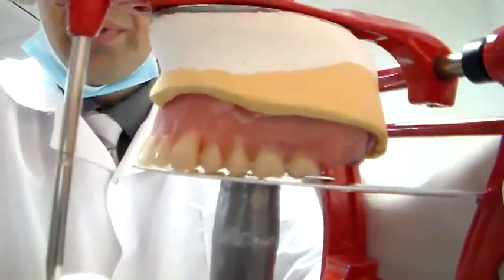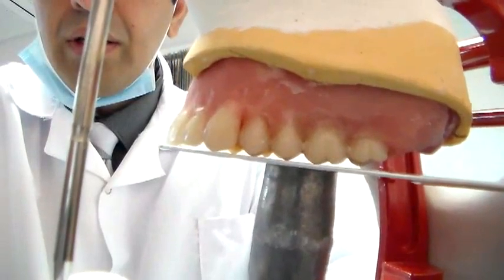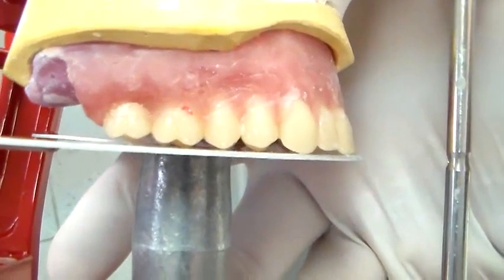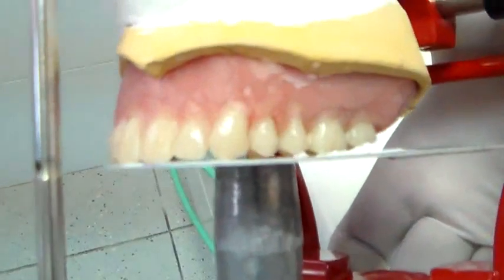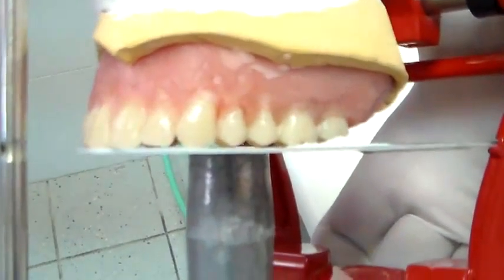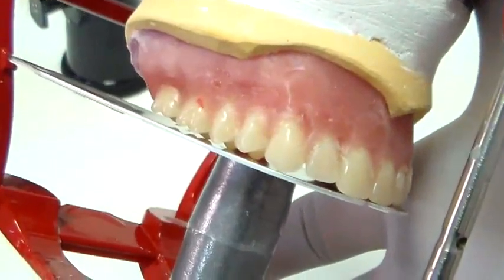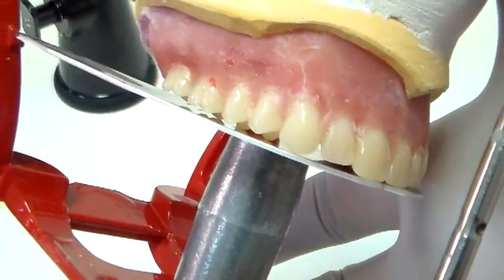As you can see, we use a scheme where the palatal cusps are touching. You can see there that all the palatal cusps are touching — the same thing on the other side. On this side as well, you can see that the buccal cusps are open and the palatal cusps are touching.